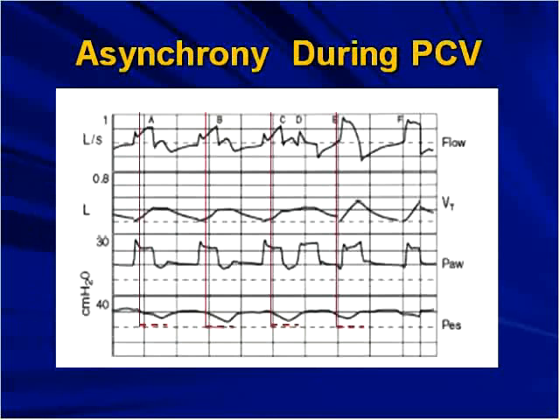Now, this is from a study we published in Respiratory Care back in December, I think, of 2005, comparing volume and pressure modes during ARDSNet. And what I want to draw your attention to is here's kind of the standard flow wave pattern we'd typically see in pressure control, kind of a decelerating flow. It's hunched out a bit because the patient was sucking in. But notice in these first 3 breaths, that we have an abnormal pressure control flow pattern. And on the pressure, we have these huge pressure spikes at the beginning of the breath.